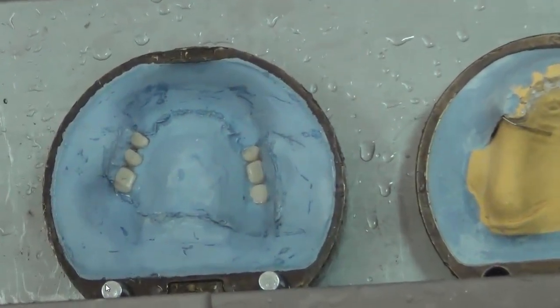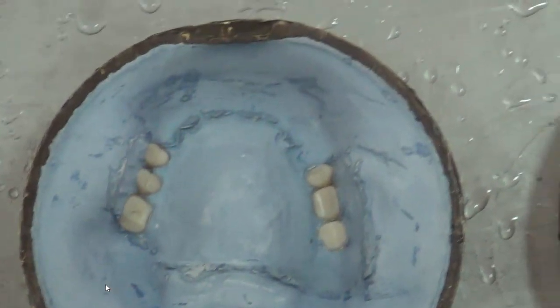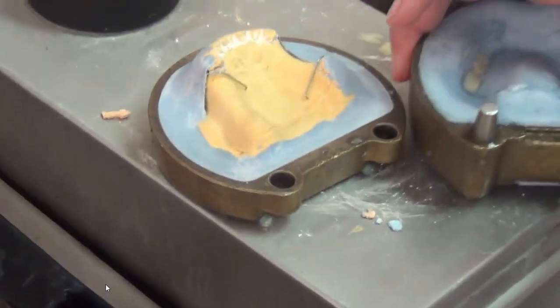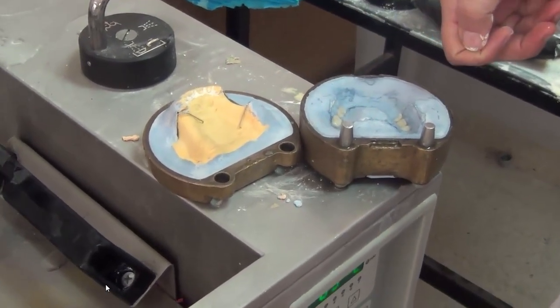Once we have finished the dewaxing step, you would find that you have the lower member and the upper member separated. In the lower member, no longer we have wax, but we have the cast and the clasps. In the upper member, we have the teeth embedded in the layers. So this is a dewaxed flask. We take it out, and while it's still warm, we dry it by air and then do a separation step.